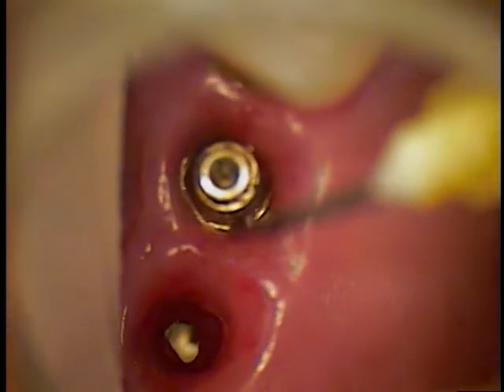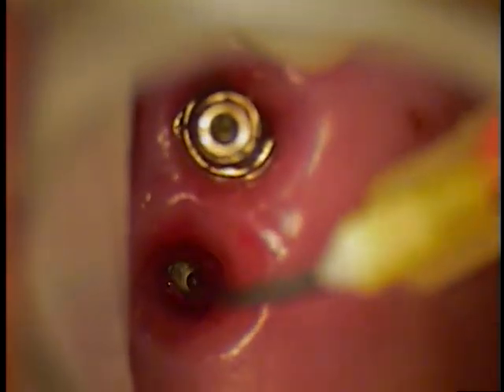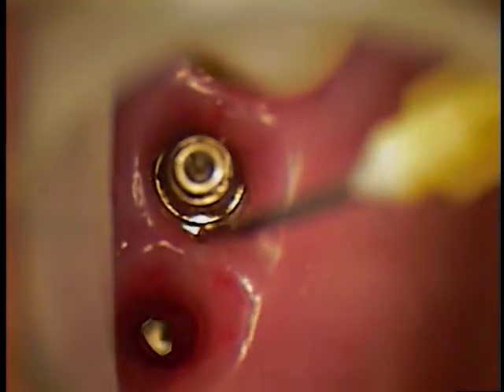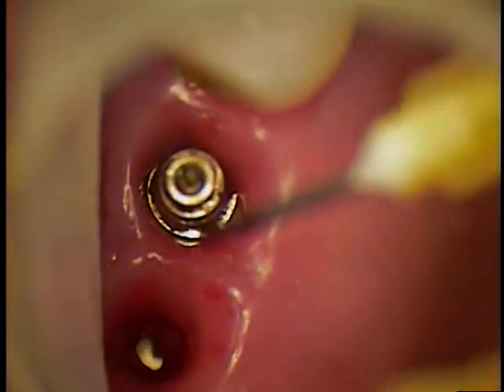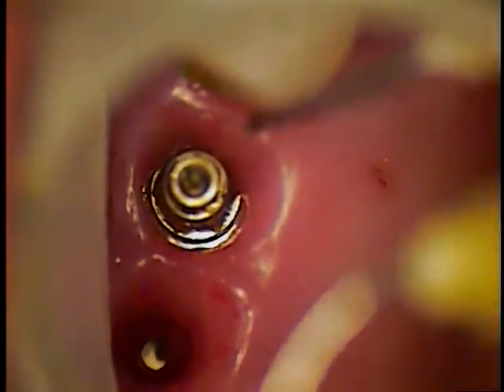You probably could have that implant removed in a procedure where they can unscrew the implant and put another one right back in place. You doing okay? So that might be a way to go on this one. Let's get the other one out. I'm hoping that there's no problem with this one. Same driver.